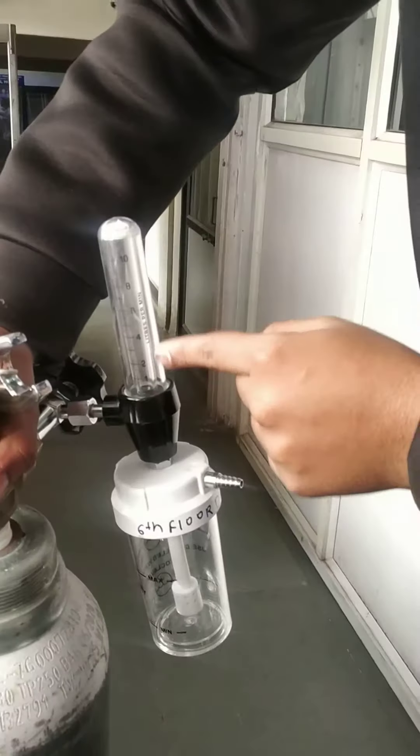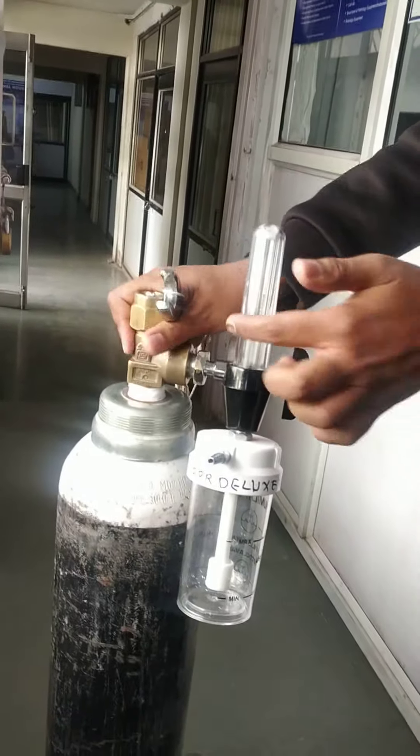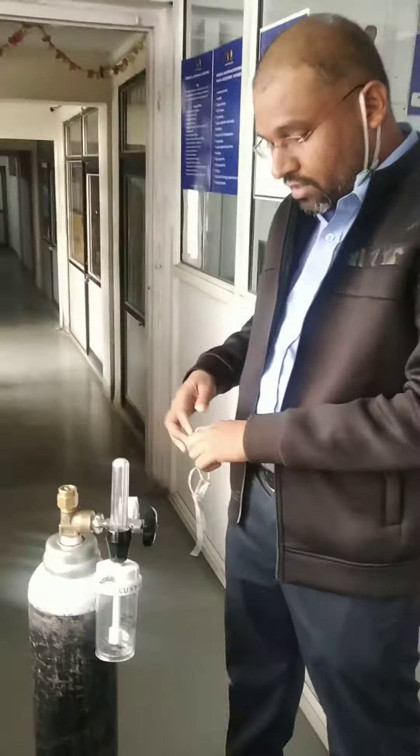According to the requirement of the patient, set the flow. These are the 3 things you have to keep in mind.